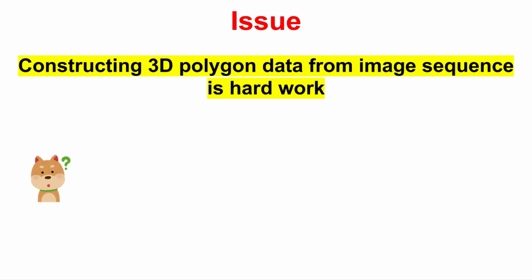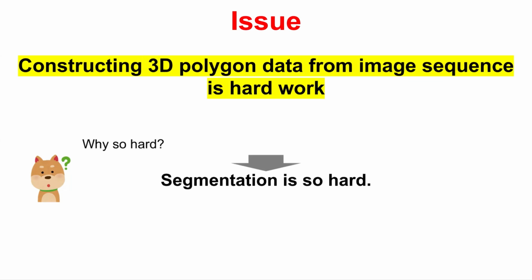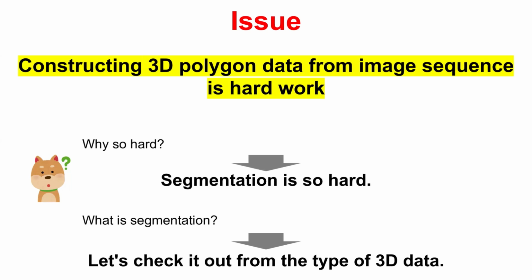However, there are also issues. Constructing 3D polygon data from image sequence is hard work. Why so hard? Because segmentation is so hard. What is segmentation? To answer it, let's check it out from the type of 3D data.